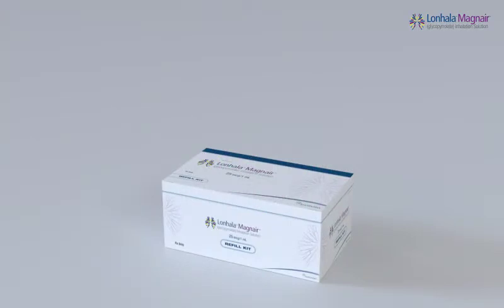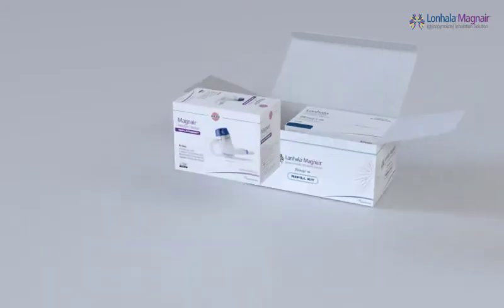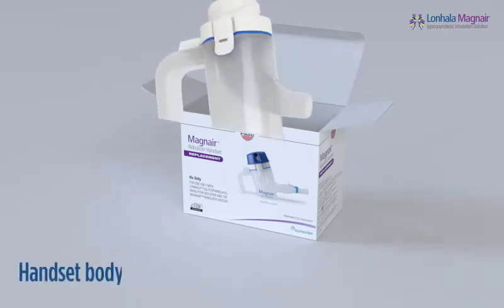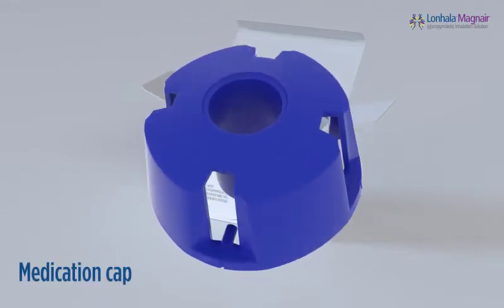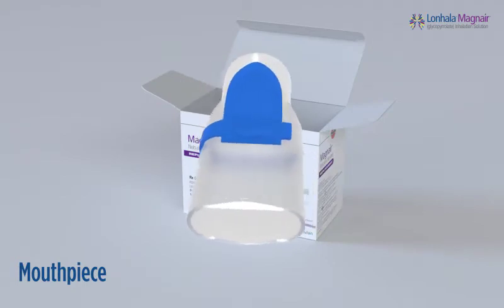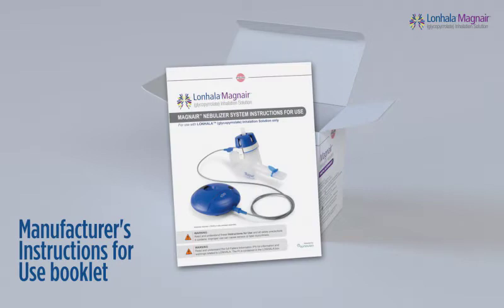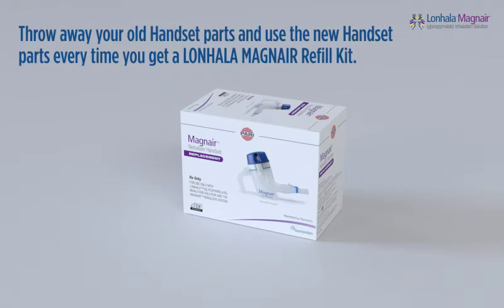Please remember that you will need a refill kit after every 60 doses. Your refill kit contains a supply of Lonhala and a Magnair replacement handset. The Magnair replacement handset includes only these replacement parts: handset body, medication cap, mouthpiece, aerosol head, and manufacturer's instructions for use booklet. Throw away your old handset parts and use the new handset parts every time you get a Lonhala Magnair refill kit.